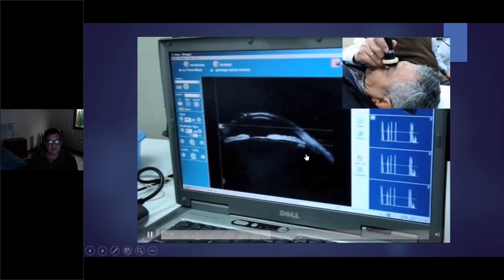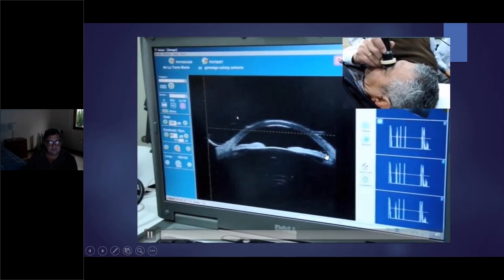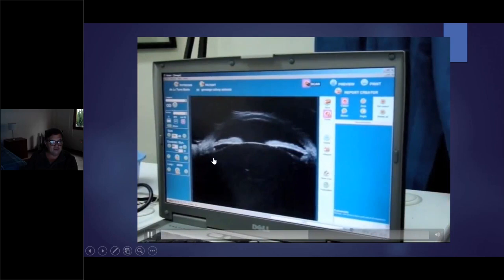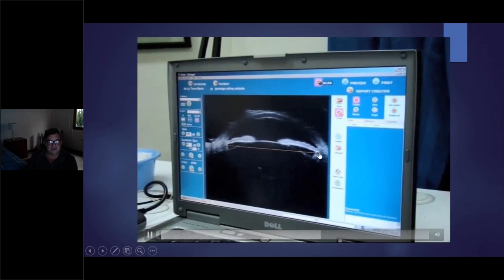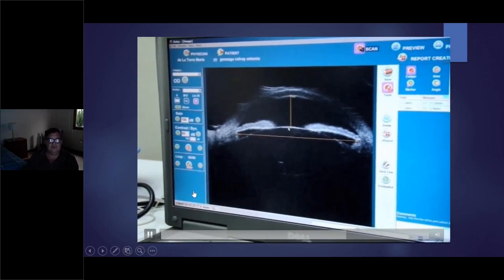And you are looking here at the iris, the ciliary body, the zonula, very nice. And also the cornea. But look, the cornea is much, much better at the posterior. If you want to see the cornea, you must go a little bit deeper and you can make measurements, sulcus to sulcus in this case. You can make the scleral spur in this position also. Anterior chamber from the endothelium to the anterior capsule. You can make the measure for the lens thickness.